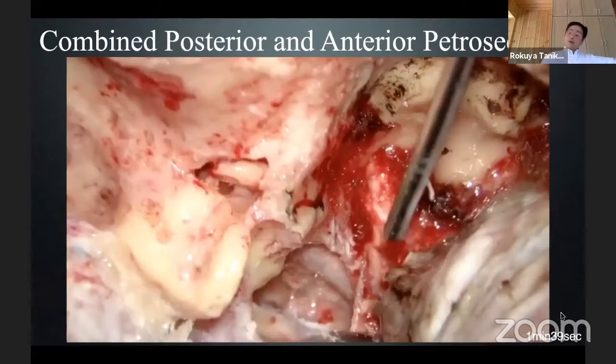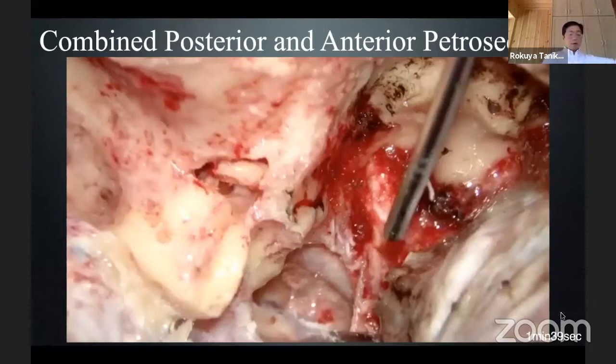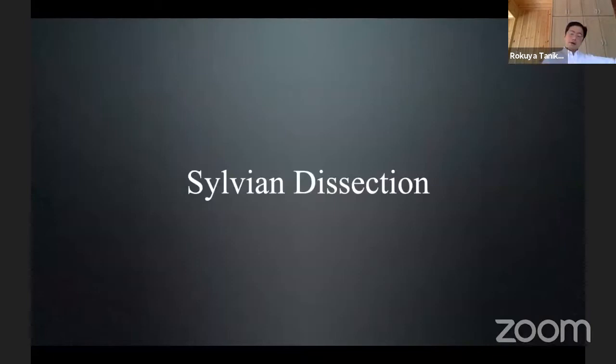We need complete hemostasis to see the anatomy. Without complete hemostasis, you cannot see anything. Everybody knows the temporary occlusion time of a micro-anastomosis is always prolonged by incomplete hemostasis. If bleeding comes into the subdural space from epidural, it always prolongs temporary occlusion time. So I always emphasize hemostasis.